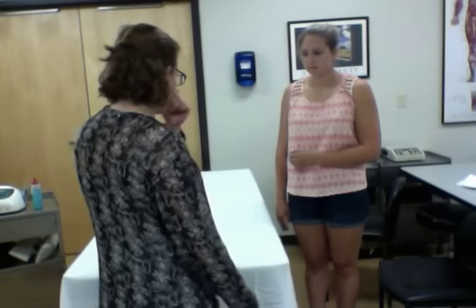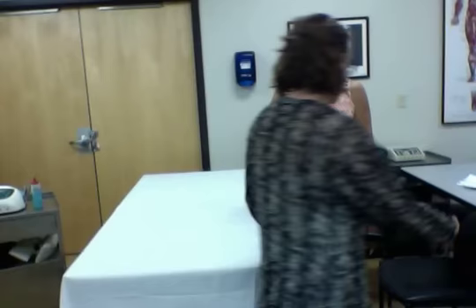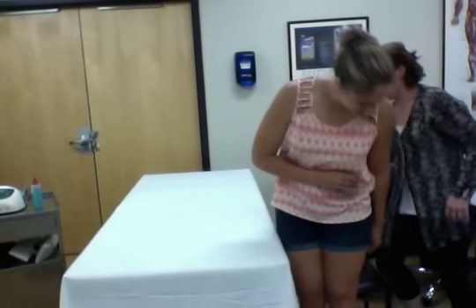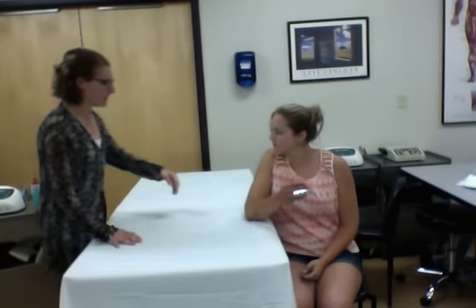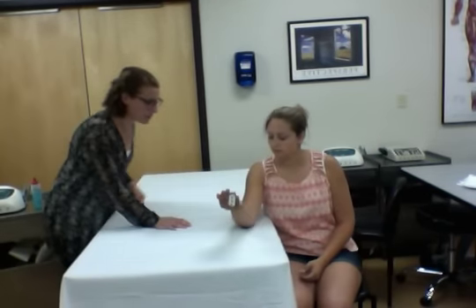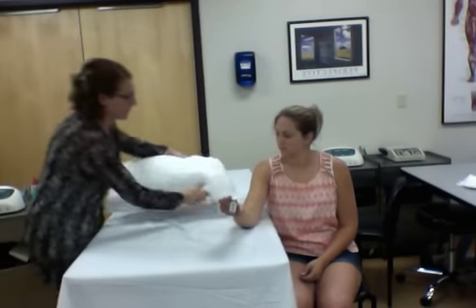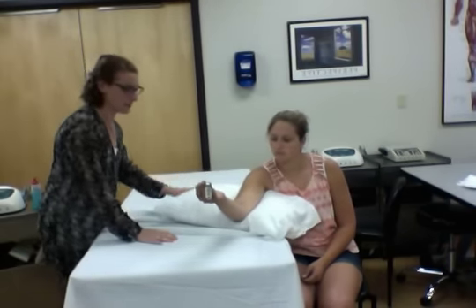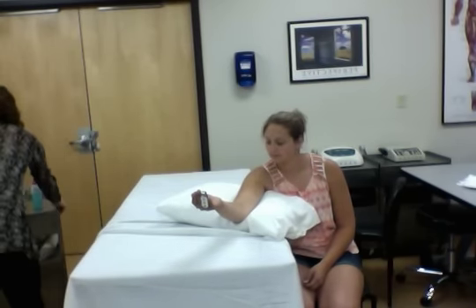Actually, we're going to pretend that it's your left arm. Oh, okay. Look at that. So we're going to have you sit in this chair, facing forward, and just go ahead and let your arms relax there. And I'm going to put a pillow underneath the top part of your arm here. You can just relax and let your elbow kind of extend as far as it will go. So we'll pretend that that's as far as it can go.